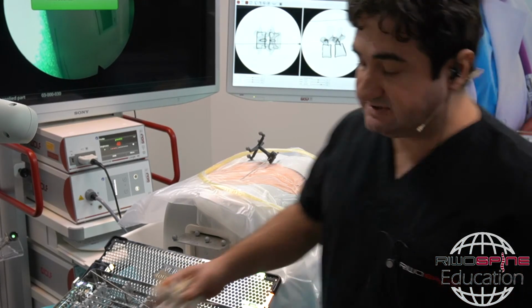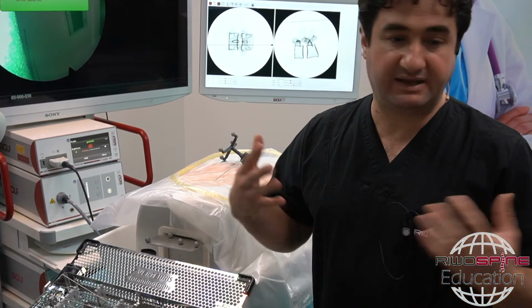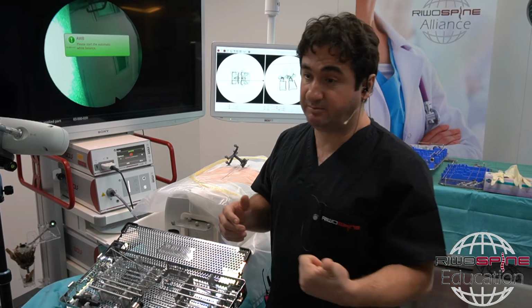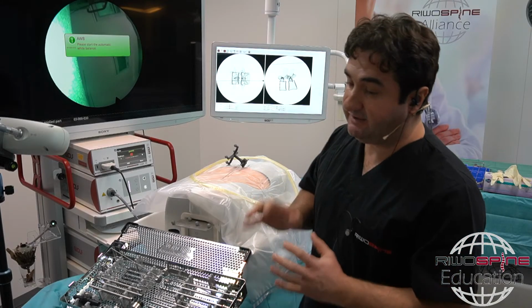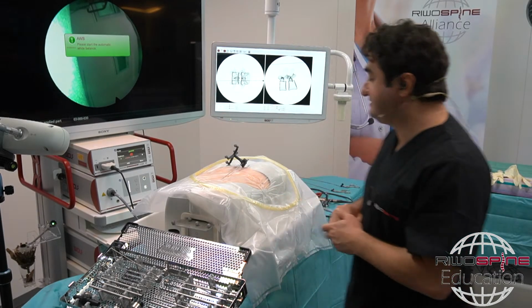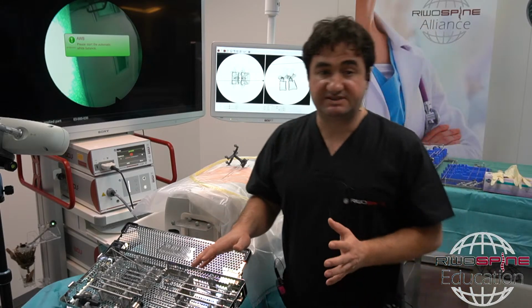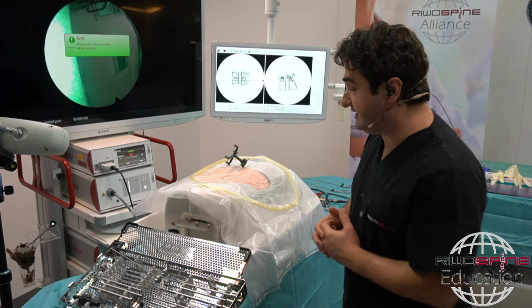You will see, of course, the large foraminal anatomy when you take an image after the operation, like a CT or MRI. You will see that the foramen is large, but it doesn't mean that you can decompress the exiting nerve root or traversing nerve root. Again, it is just to have a better access to the spinal canal. Of course, you can do this procedure with manual drilling or full-endoscopic drilling. You can do these kind of operations under local anesthesia, or with sedation, or with general anesthesia.